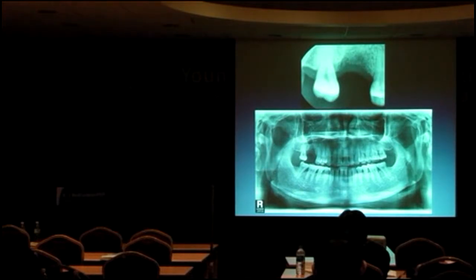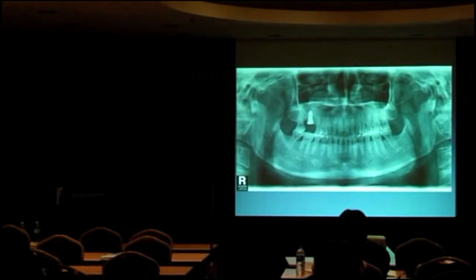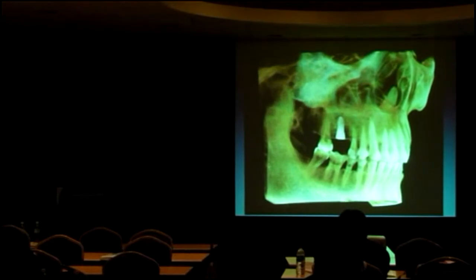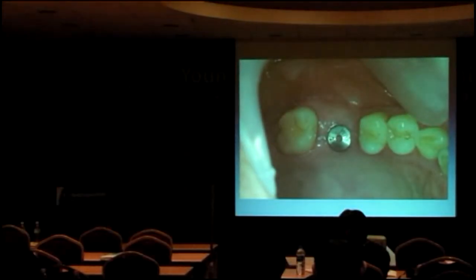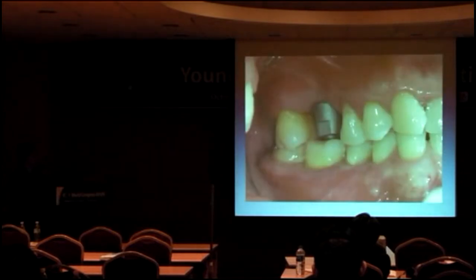A 60-year-old Korean male came to my clinic with a single tooth missing. I examined the CT scan and placed the implant. This is how it looks after placement. And I realized three months later the implant was placed too palatally and too distally. I don't agree with people who tell us you have to use the customized abutment. Some cases are fine with the prefabricated abutment, but some cases may be unique because of location and angulation of the implant. So this case was kind of that.